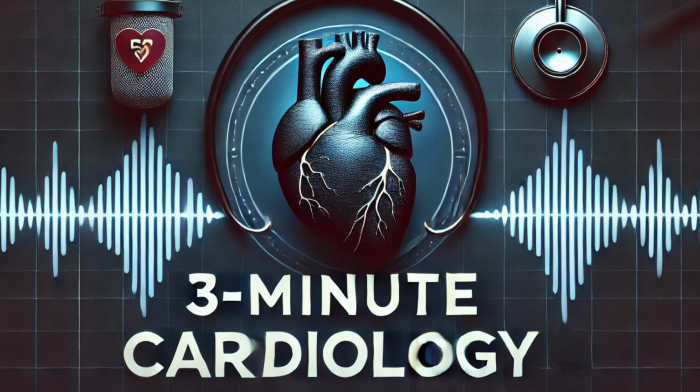If it's an irregular rhythm, something like atrial fibrillation, you can count the number of R waves on a 10-second strip and multiply that number by 6. That'll give you the total number of R waves in 60 seconds. Normal is 60 to 100, bradycardia is less than 60, and tachycardia is greater than 100.